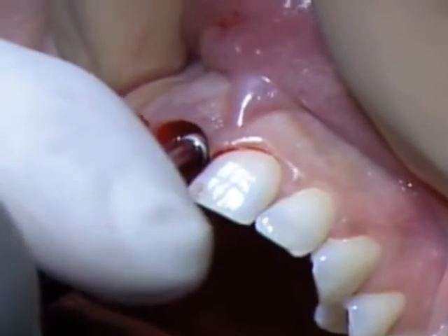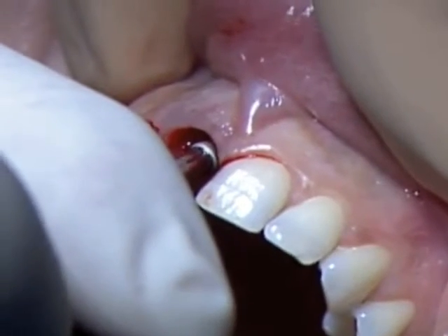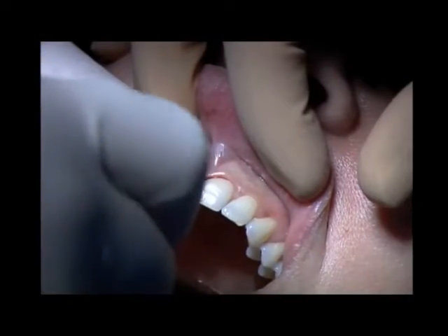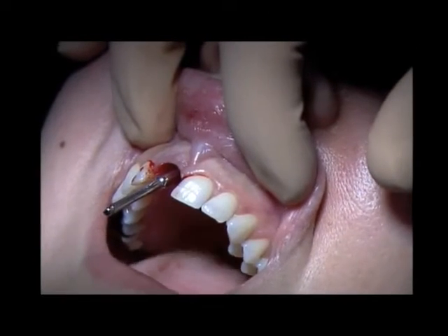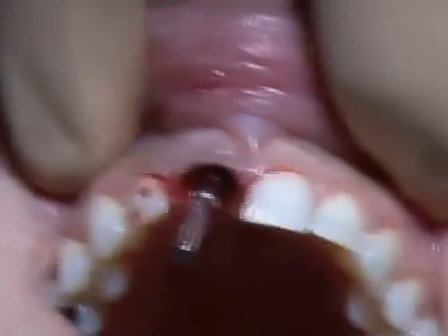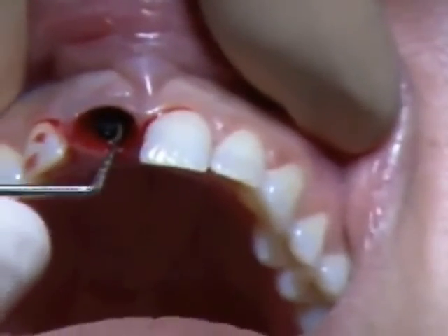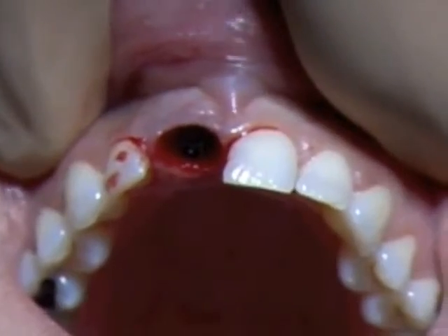So in this way we will place our implant slowly in the preferable position, and then we will remove our handle to check the three-dimensional positioning. You see here the implant placed. We are 2 to 3 millimeters below the free gingival margin, and we left a gap in between our implant body, quite a big gap, and the buccal plate.